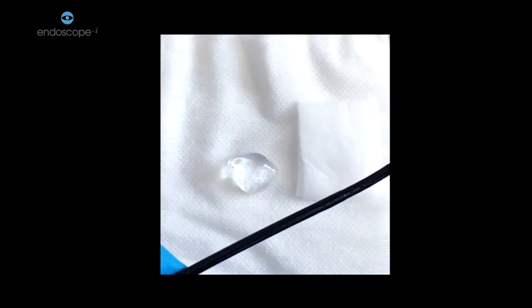Before threading, make sure that your scope is anti-fogged with an alcohol wipe and also well lubricated with some Aquagel.